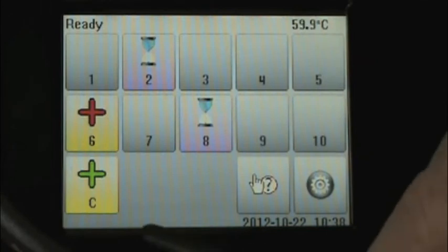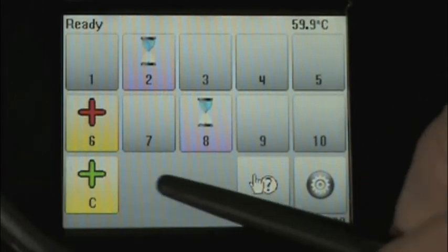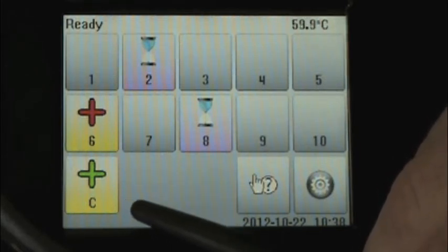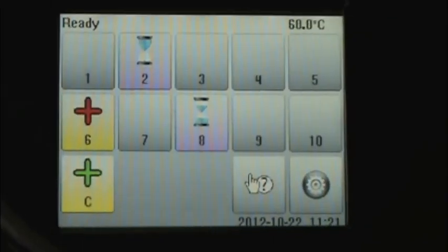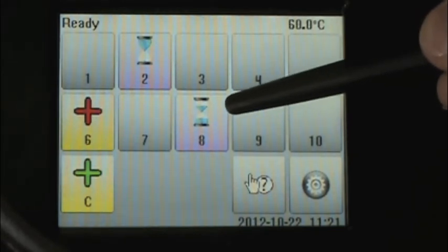I'd like to point out that in the positive control cell, we expect spores to grow, and thus we have the yellow result with the green positive indicating growth positive, and green indicating this is the desired result. If we had a positive control BI that failed to grow, the readout would be on a purple background because the media is still purple, and we would see a red negative sign indicating a growth negative result — and red indicating that this is an undesirable result from a biological indicator where growth was expected. The hourglass icon is also representative of the amount of time the biological indicator has been in the incubator. Here we can see in cell number two the biological indicator was freshly inserted and the hourglass is empty. In cell number eight, the biological indicator has been in the incubator for a longer amount of time, and you can notice the change in how the icon is pictured.